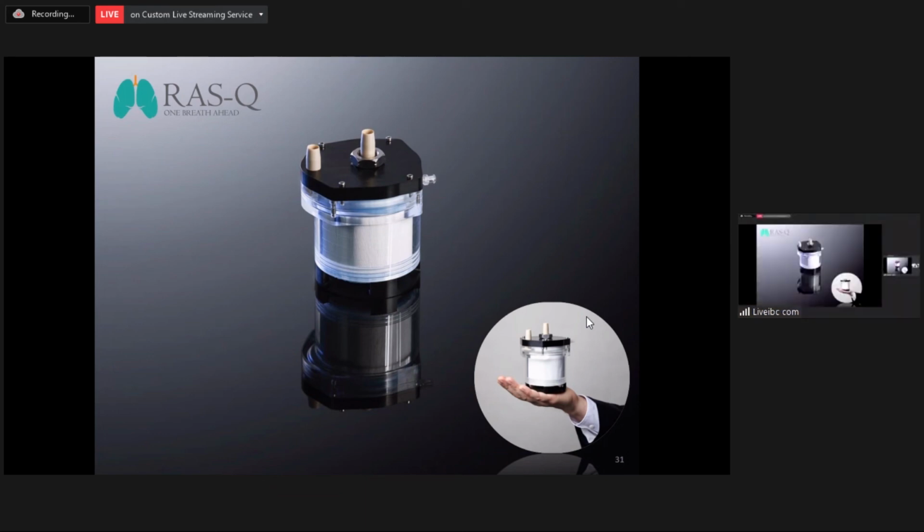The other question, I think I raised it when we had a discussion in the past. This compliance chamber that you speak about, I understand that it helps in absorbing the systolic pressure from the pulmonary artery. But have you considered incorporating some kind of, I know the material science is a limitation, mimic a normal lung and have an expansion and contraction of the fibers when gas is passed through the oxygenator?